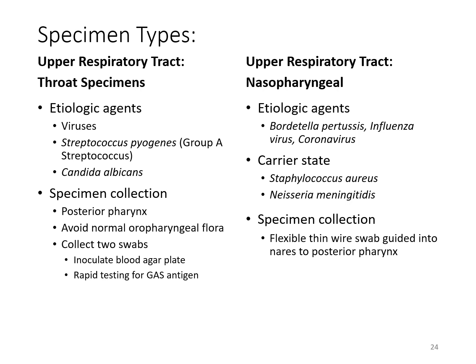With your nasopharyngeal specimen, this is usually looking for upper respiratory tract infections like Bordetella pertussis, flu virus, and coronavirus. Those specimens are obtained using a very thin, flexible wire swab that is guided along the nares to the posterior pharynx. Basically it's going way back along the base of that nasal path. Once you get tears and you've reached the back, you've hit the right spot.